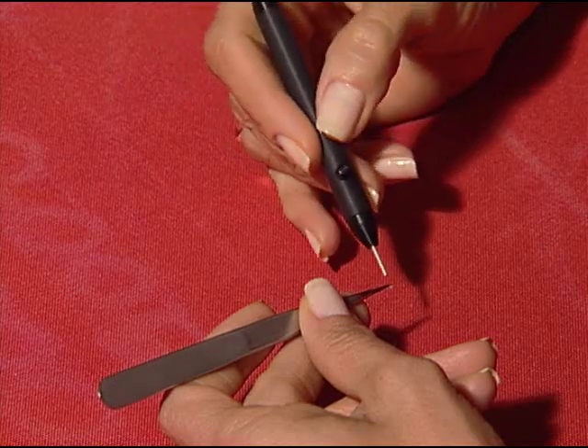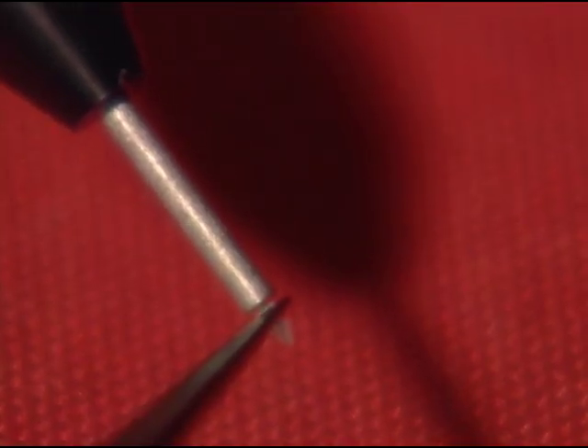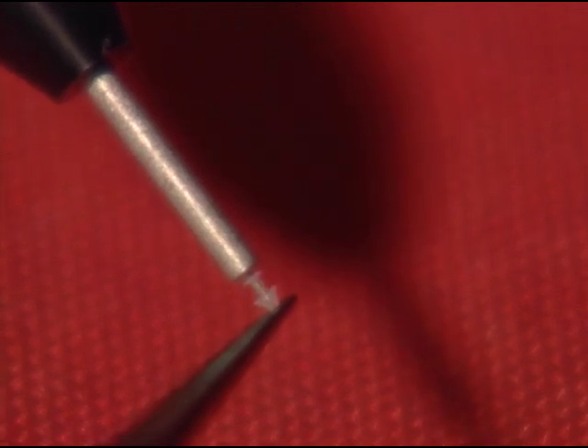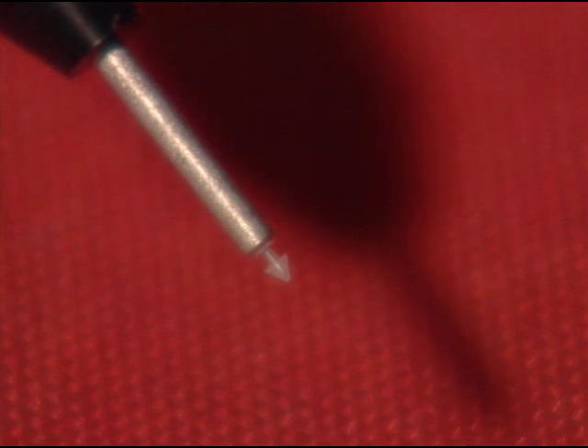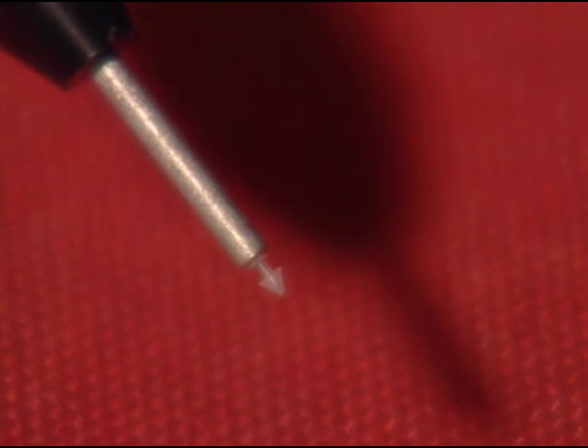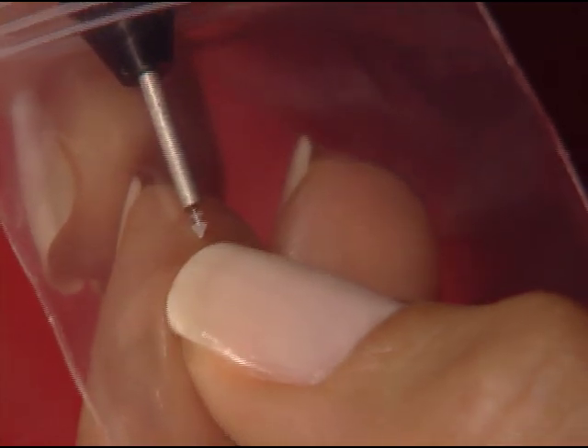To load an occluder from a bulk bag, use forceps to hold the shaft of the plug while carefully guiding the inserter pin into the dome end. Once the occluder is about halfway onto the pin, move the forceps onto the nose portion and push until the pin is completely in, being careful not to tear or puncture the plug.